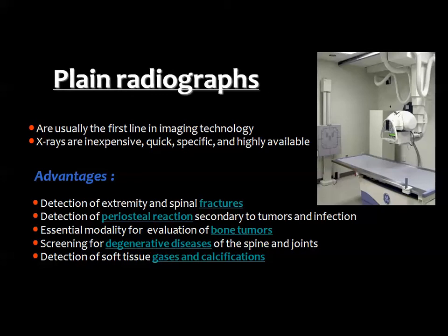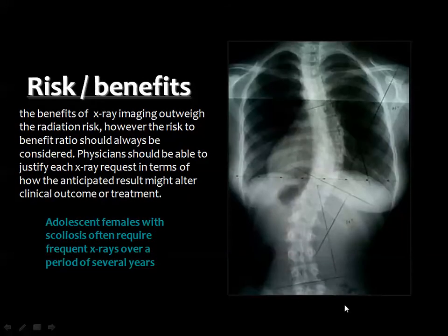And if the findings can explain the patient's symptoms, then you have reached the diagnosis. But if the patient complaint could not be explained on the basis of X-ray finding, you may need further evaluation like CT or even MRI. Then X-ray is very valuable in detection of calcium in the soft tissues, and also the detection of gas. The presence of gas in the soft tissues may indicate an underlying infection.